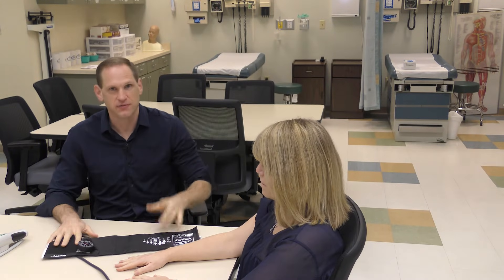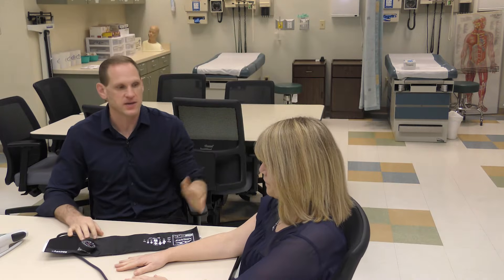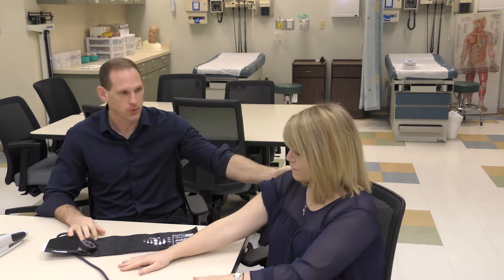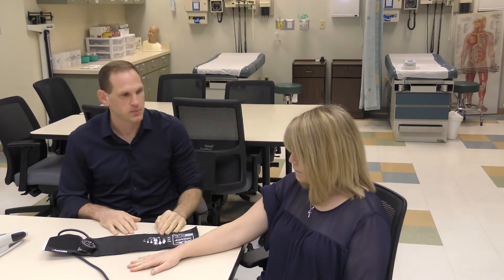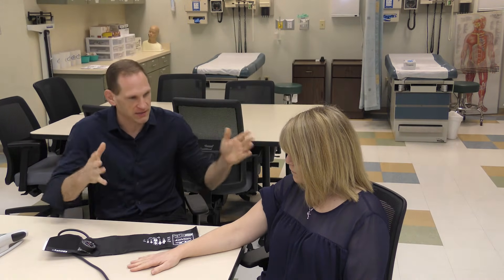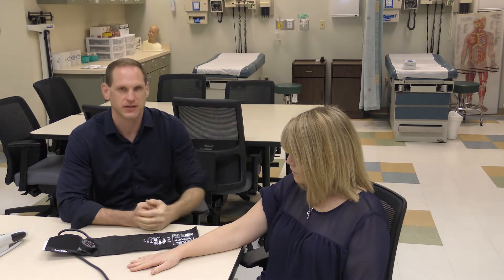When it comes to taking the blood pressure, the first thing is make sure you've got the right size cuff — we just talked about that. Next, the patient should be seated, back should be supported, feet should be on the ground, legs uncrossed, and arms should be supported at about heart level. If you don't have these things in place then you're going to have an incorrect reading.